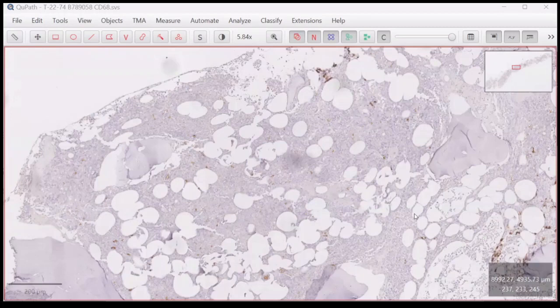CD163, if you notice, but then during practice, you will find the CD163 will also stain the monocytic dendritic cells. So, but then you just focus on the monocytic series. If you rely entirely on CD68, CD14, and CD163, it would be very dangerous.